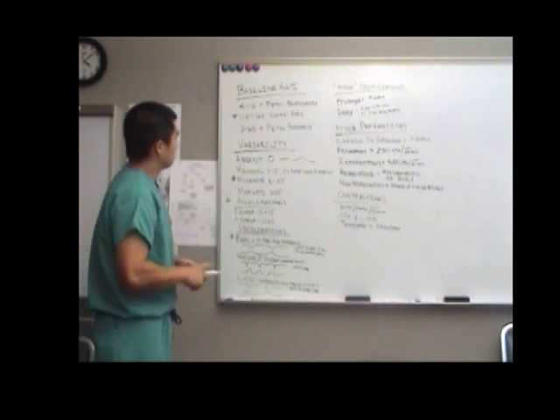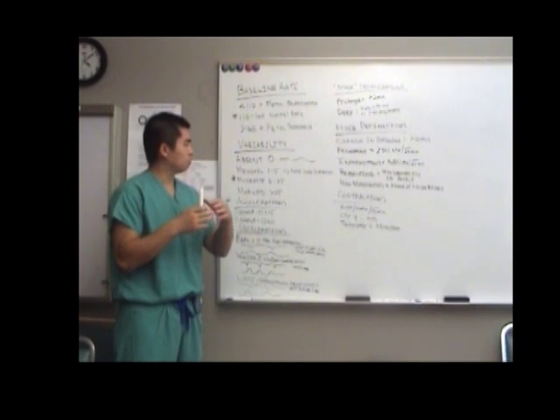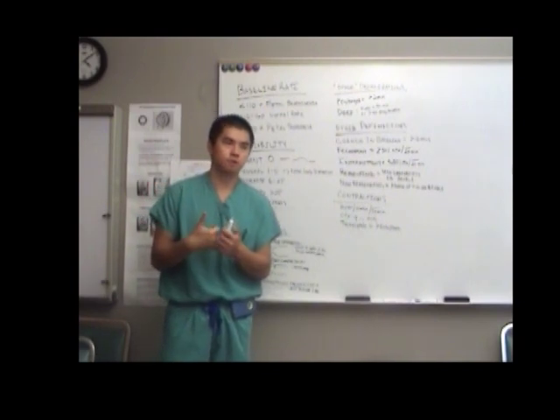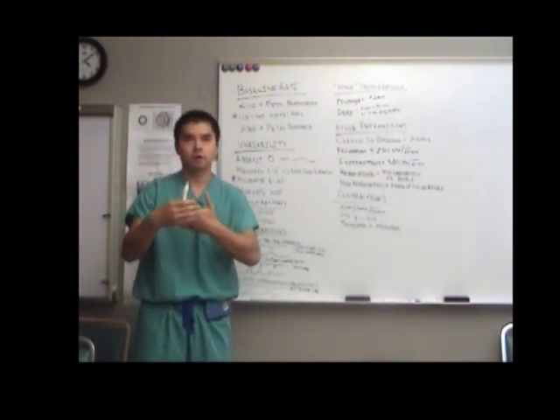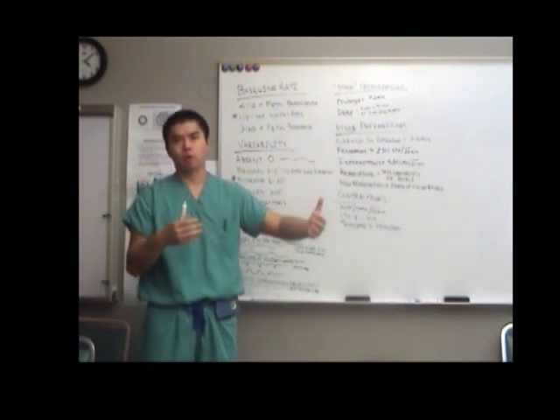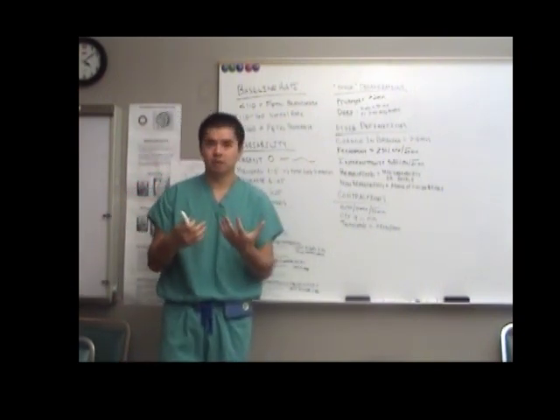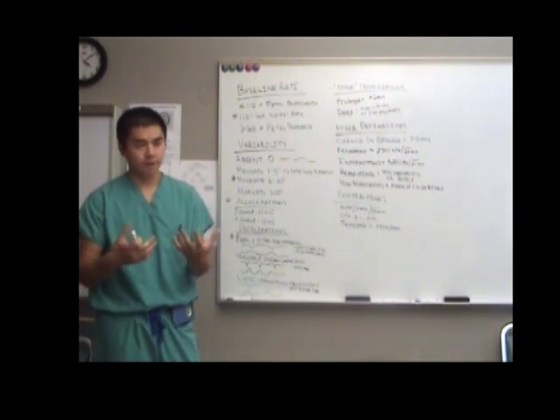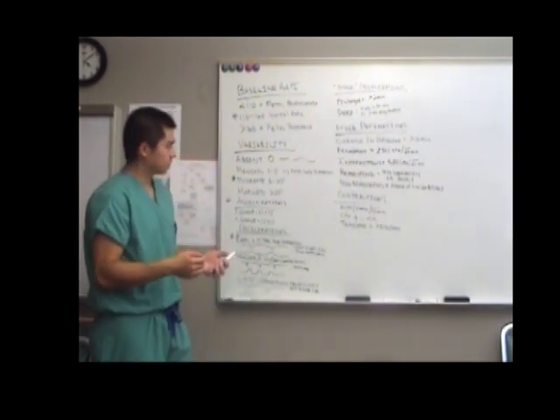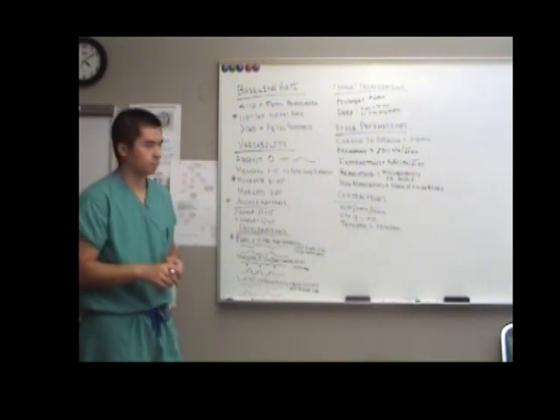And so, again, if I didn't mention this earlier, your goal when you're describing a fetal heart tracing to someone, especially over the phone, or when someone doesn't have the fetal heart trace in front of them, which is often the case, is to describe it in such a way that the person listening to you can visualize and redraw the same tracing that you're looking at. Your description should allow them to reproduce close to verbatim what you're looking at on the monitor.